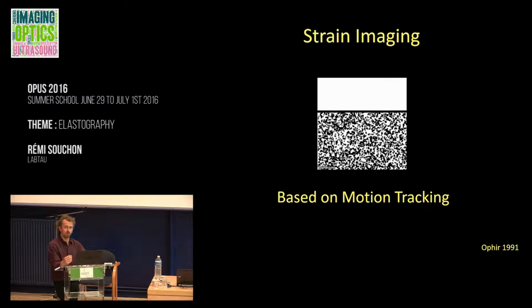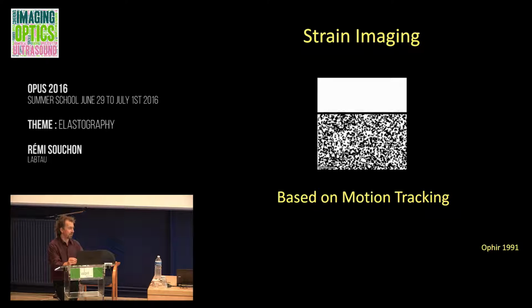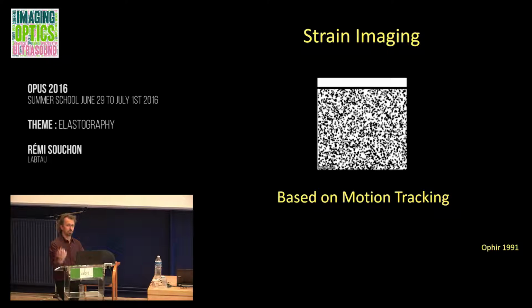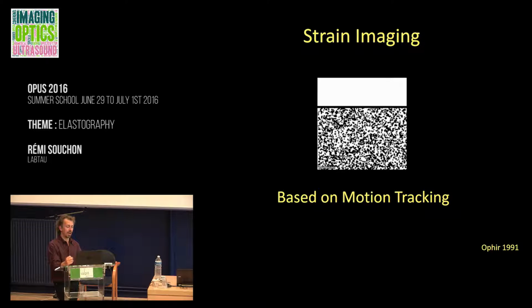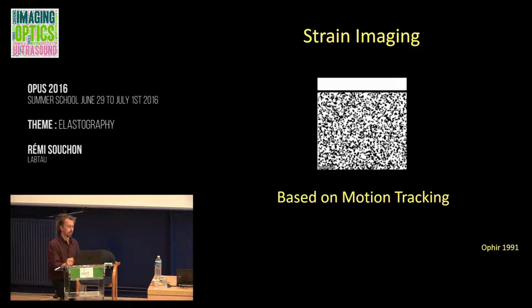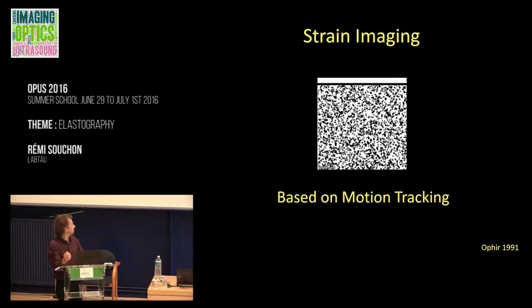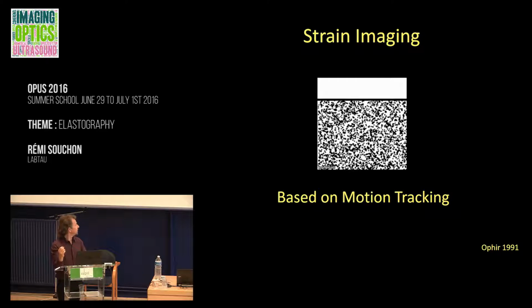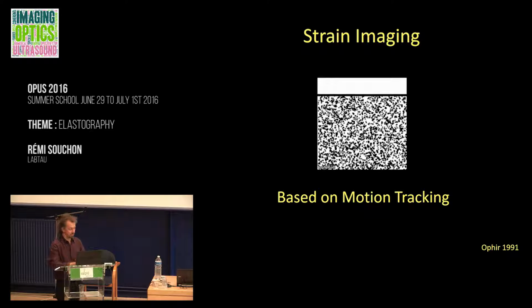The speckle is actually an inherent property of the ultrasound image that we get, meaning that even a uniform medium will show some speckle. And this speckle shows up as bright or dark dots in the image. What we do with speckle tracking is tracking all of these motions.